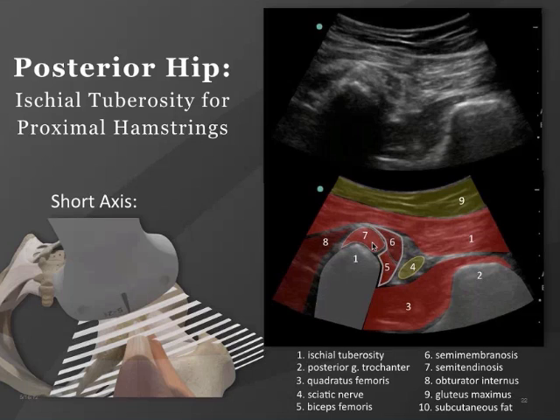You see these other muscles as labeled. And this is the area of interest, noticeably and importantly, close to the sciatic nerve. So when you're injecting these, we must be careful not to drift too far and get in trouble with the sciatic nerve.